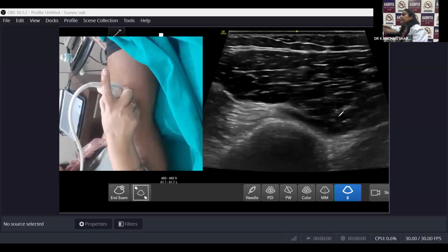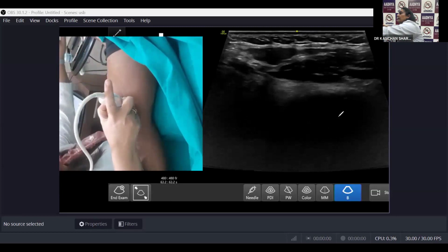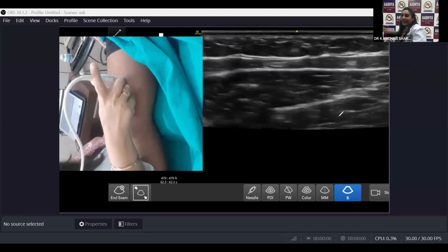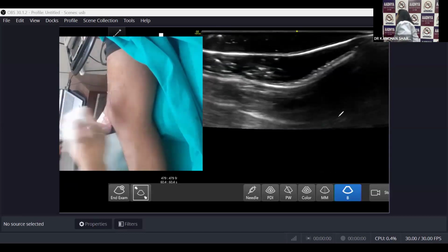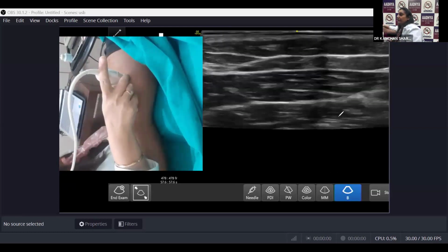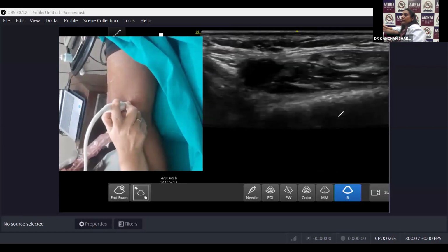Okay. So I'm coming down, down, down. Now I will reduce my depth. Okay. I'll go back. I got lost. No jelly, so no transmission. So again, this was the vastus. Okay, so we were here almost, we reached here. And then keep on coming down.